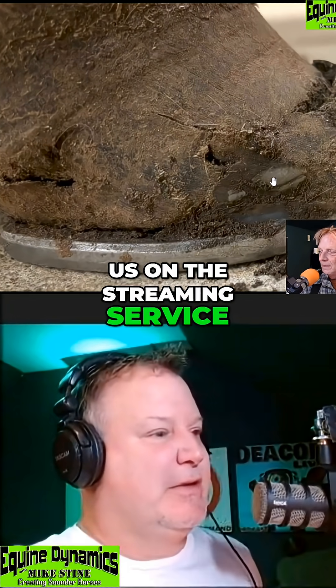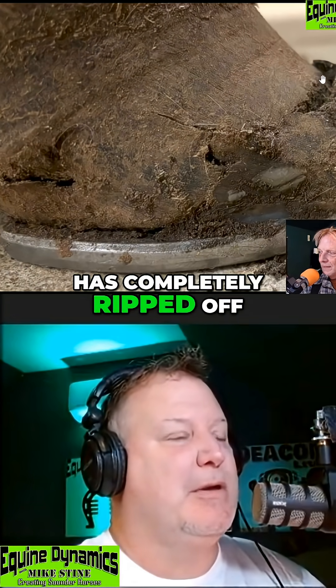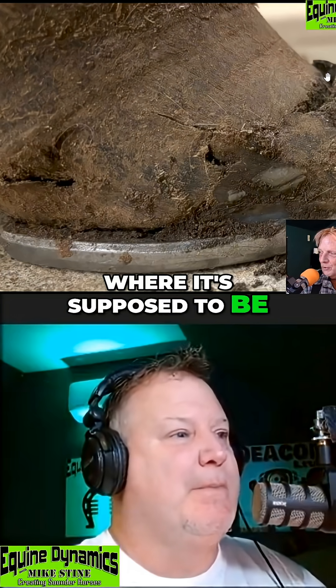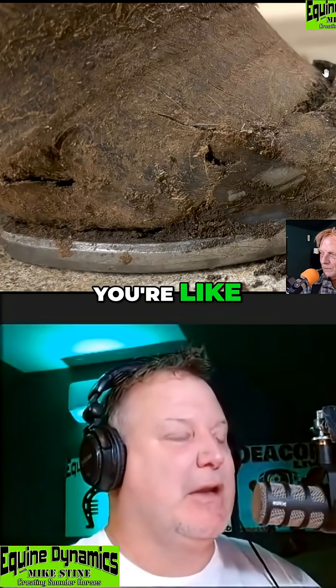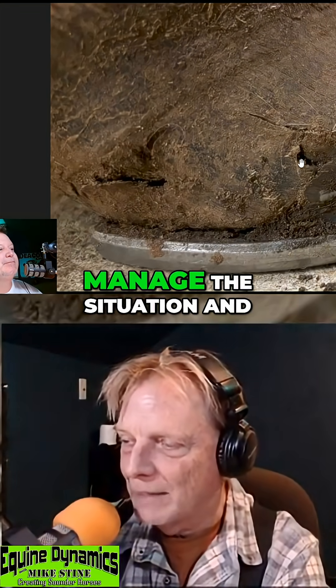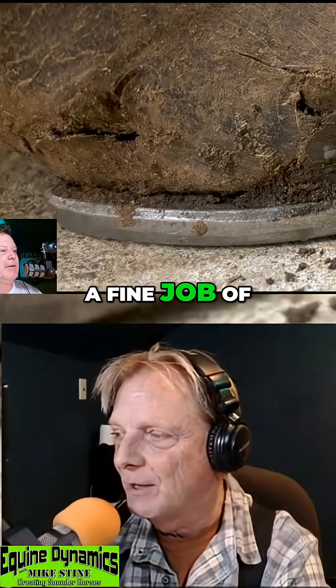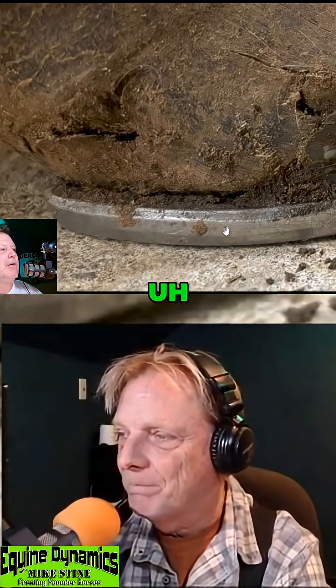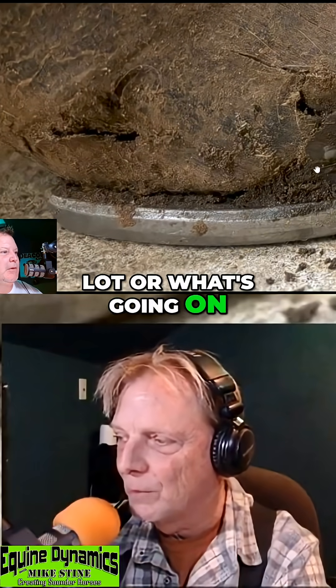To describe it for everyone listening on the streaming service — it looks like the front of the hoof has completely ripped off. It's not where it's supposed to be. It looks like it's cracked off, like if you've ever split your fingernail in the front. This is one that he was called on to manage the situation and get it back under control, which he will do a fine job of.